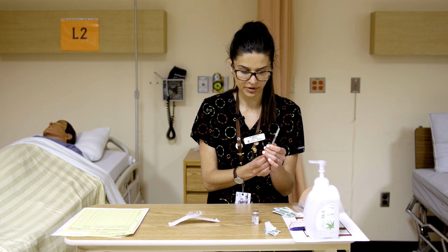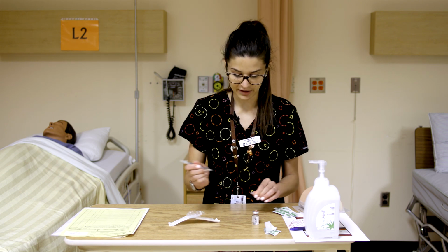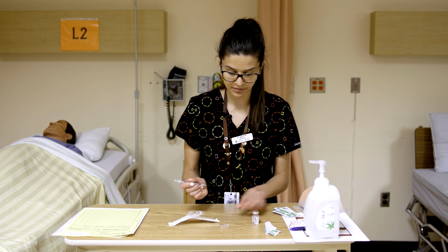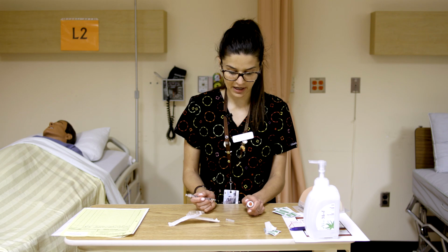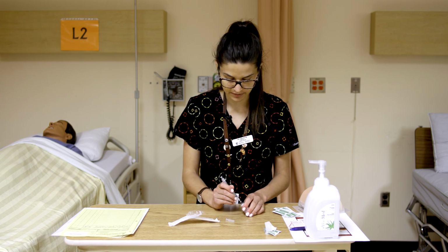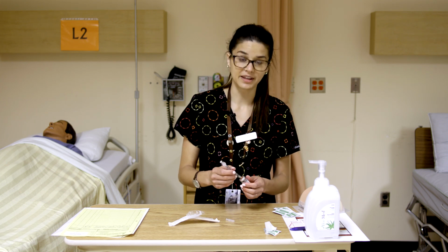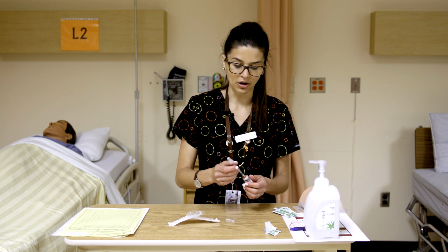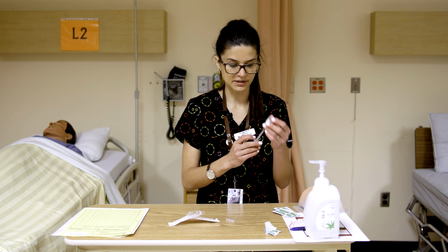So we're going to get to that 0.1 mL because we are going to inject air into our vial to start. So we're going to put our cap down somewhere we can easily access it again, and we're going to again try to stab right through the top center hole of that vial. So let's just go for it. And you could probably see these needles are fairly thin, right? So you don't want to be bending all over the place. You can actually bend and break that needle, in which case you would be starting again.